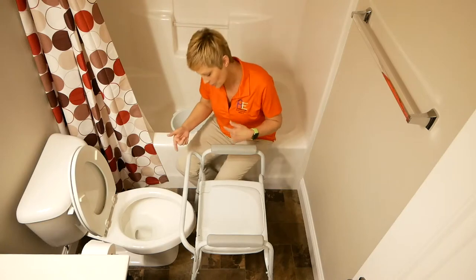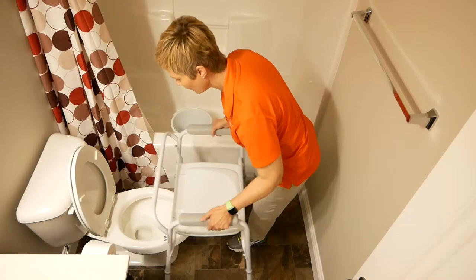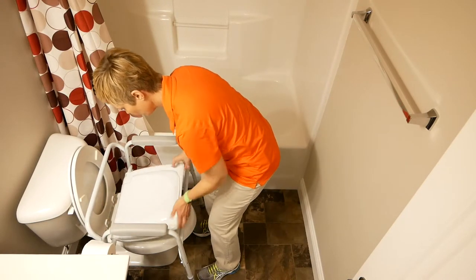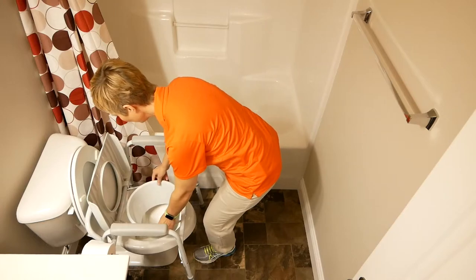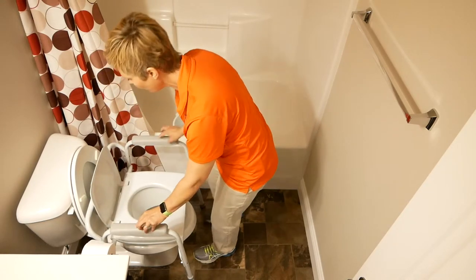This will actually fit over without me removing it. I have adjusted it for the appropriate height, so I'm going to put it right back over the toilet and then lift the seat. I'm going to make sure that the splash guard is in there and put that right down into the toilet, so it's down into the toilet, then put the seat back down.